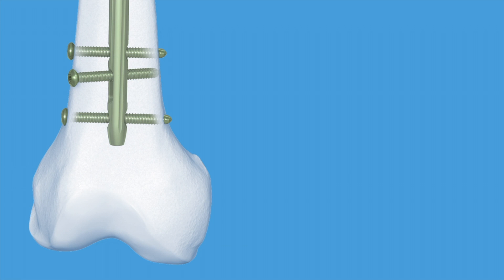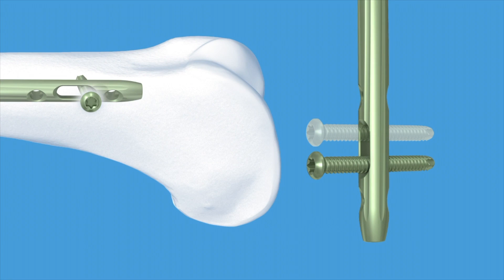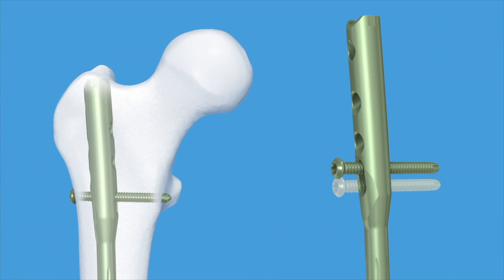In this practical exercise, distal locking will not be performed. To increase flexibility, both distal and proximal dynamisation is available.